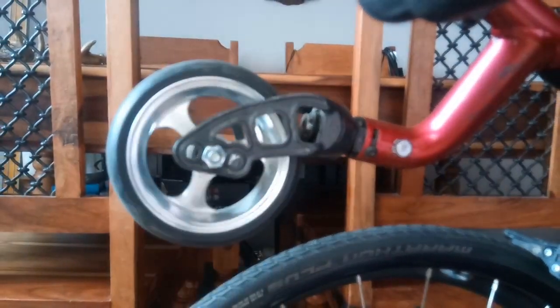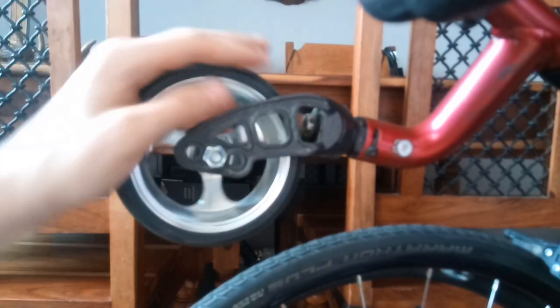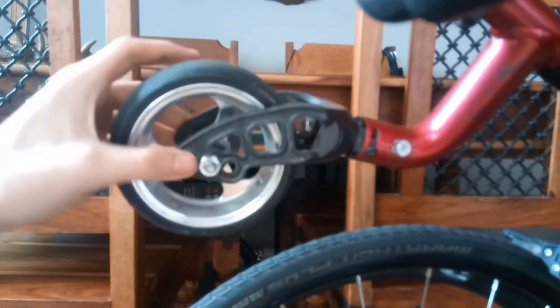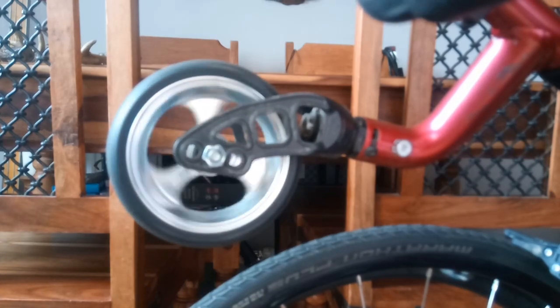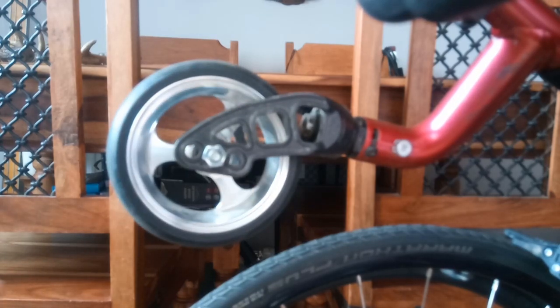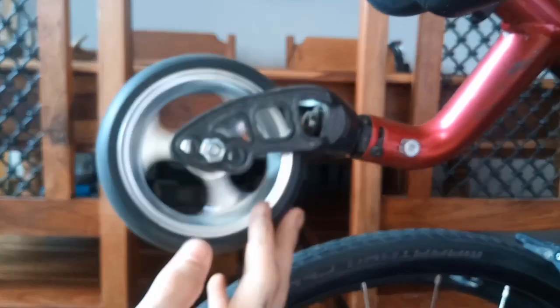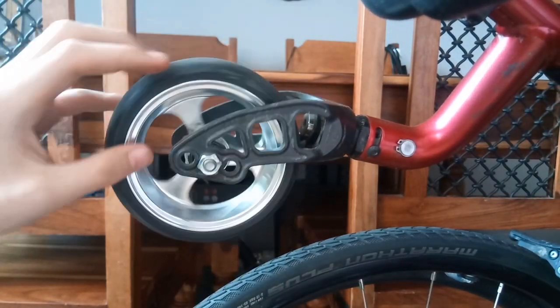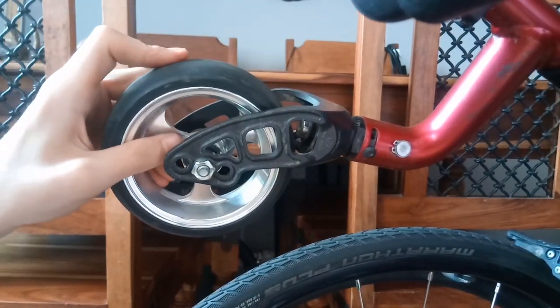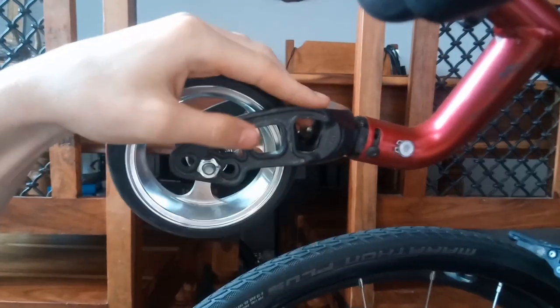In fact, I could have probably done with cleaning it a little bit more. But it rolls smoothly, as well as not being too tight and gripping onto it and giving it the death grip. So yeah, I'm going to need to undo everything that I just did for this demonstration, because I need to clean it a bit more. But yeah, that's... Actually, I might be able to get away with doing it just like this. But yeah, that's basically how I change the wheels.